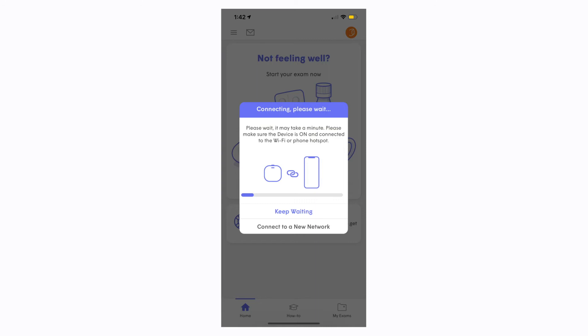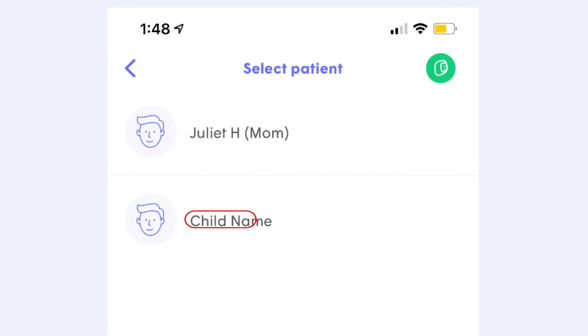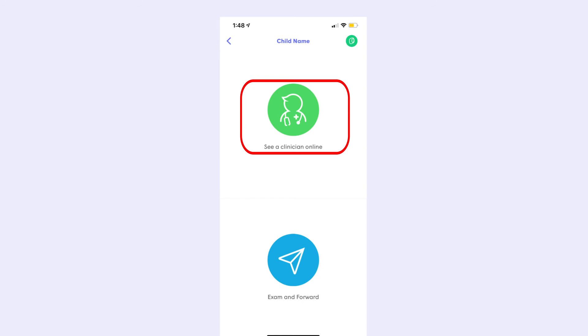Click the Start button to begin your exam. After that, you will get to select the Patient screen. Be sure to select the Patient and not the Parent. Next, select See a Clinician Online to start the exam.